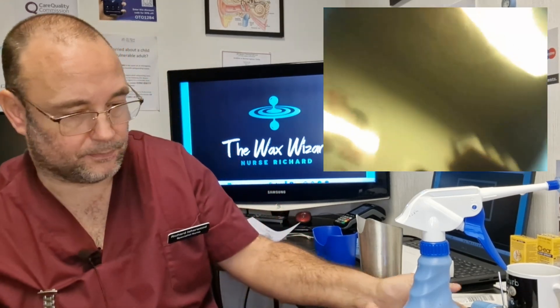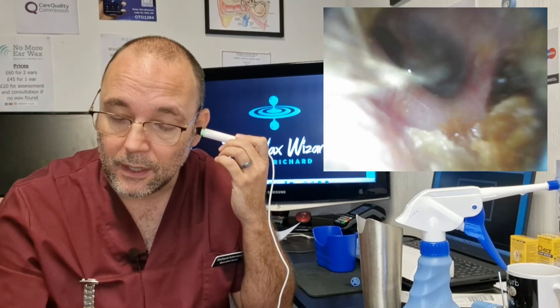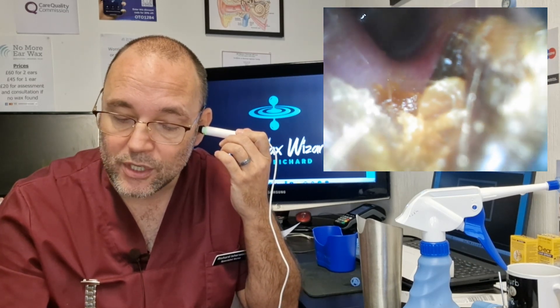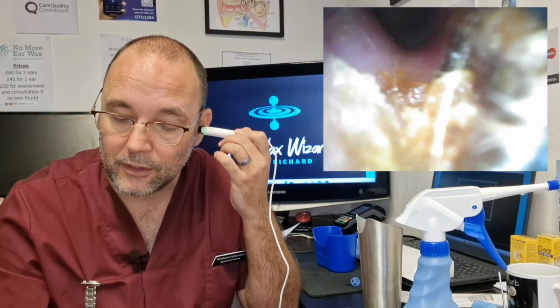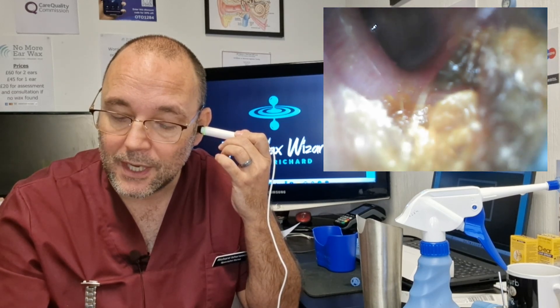I'll show you how I've done that. But first I'll show you the other one that we're going to treat. You can see my eardrum in the distance, nice and clear, and it's this bit I'm after at the base of my ear canal. It gets really itchy and irritable. It's not fully blocked, nothing that's going to be affecting my hearing, but you can see especially that darkened one there - it gets a bit sharp and you can just feel it tickling and niggling away at you. So I'm going to get rid of that. The eardrum looks nice and healthy.